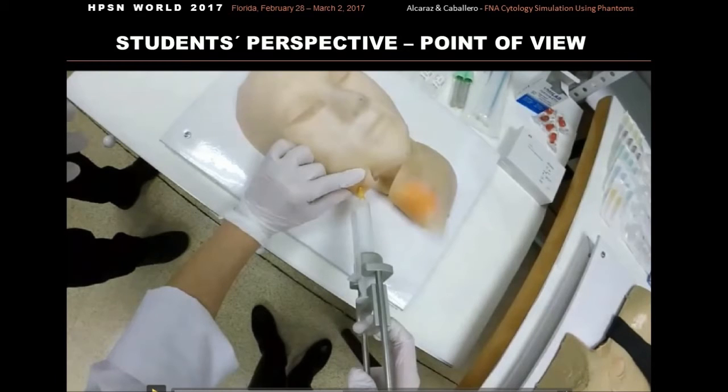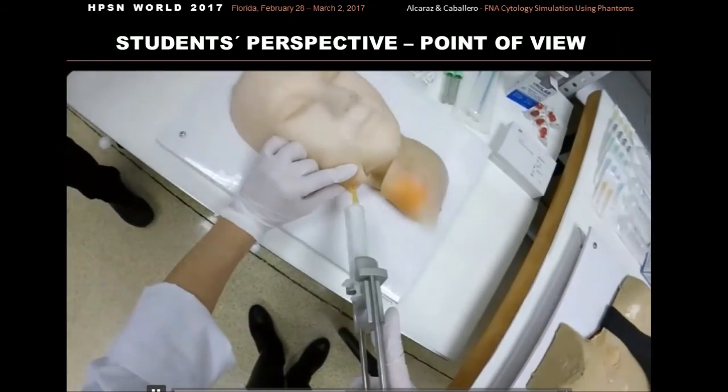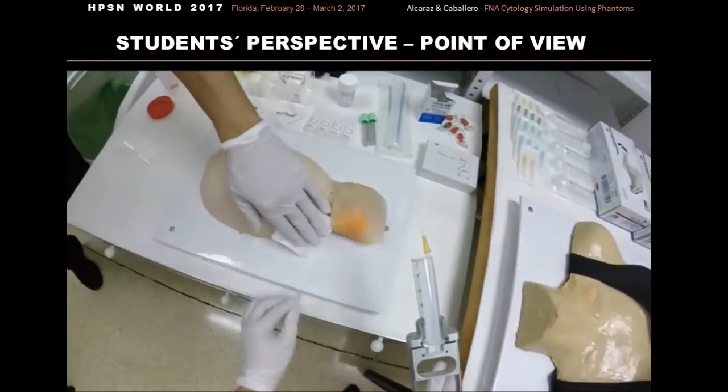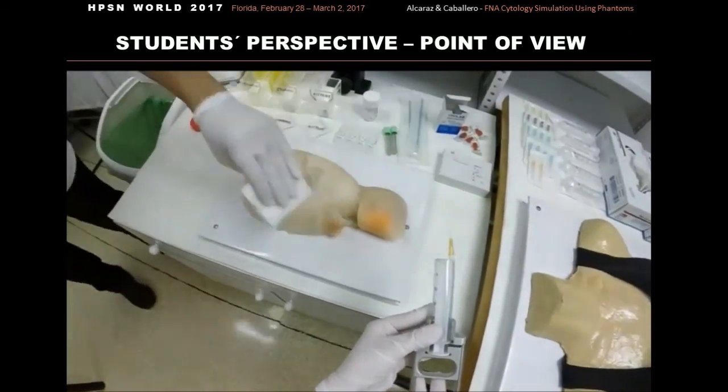Otherwise, the cells end up in the syringe rather than staying in the needle, and are dried and difficult to expel onto the slides. The student must ask for help to apply pressure over the site, to minimize bruising or to decrease the chance of hematoma formation.